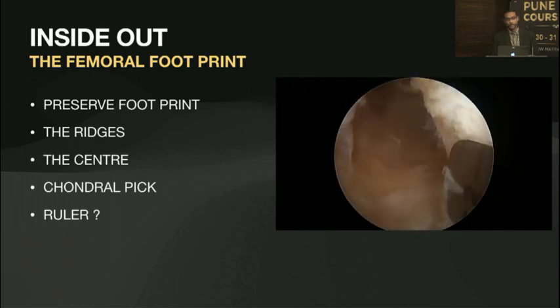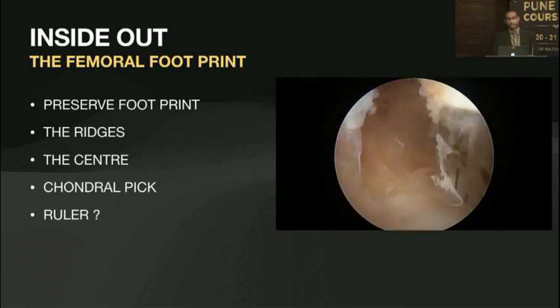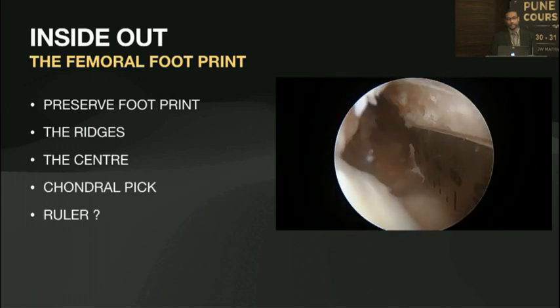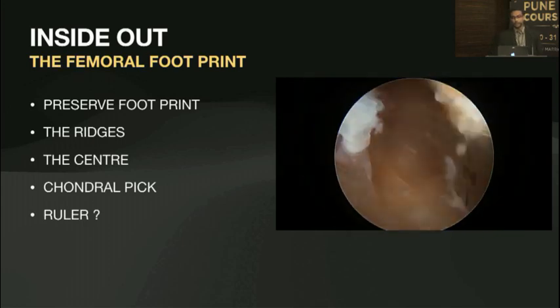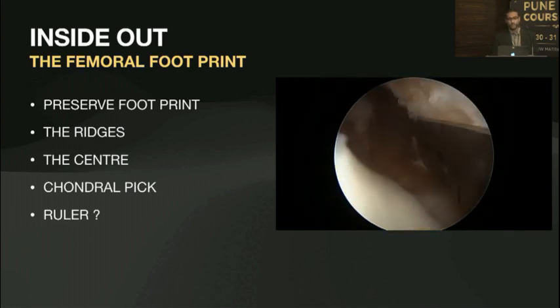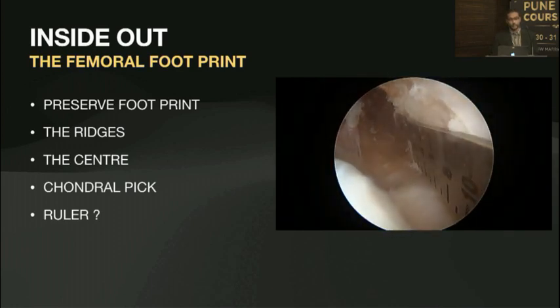We have learned about the ruler technique. It's slightly challenging if you're not used to it — you have to curve around the lateral femoral condyle. You have to make sure you're right at the back so that you know where the center of the footprint is, then make the adequate mark and drill it.